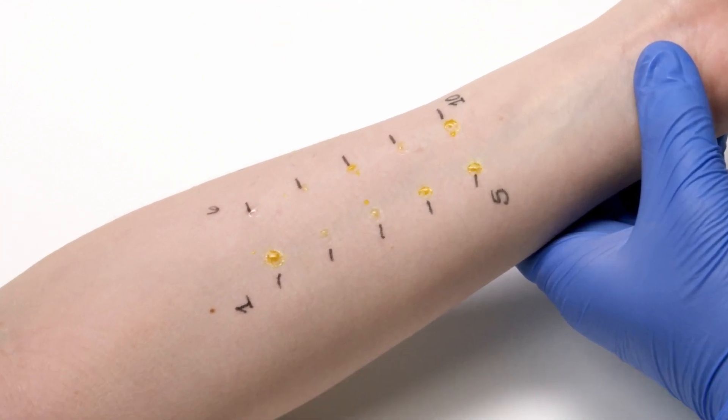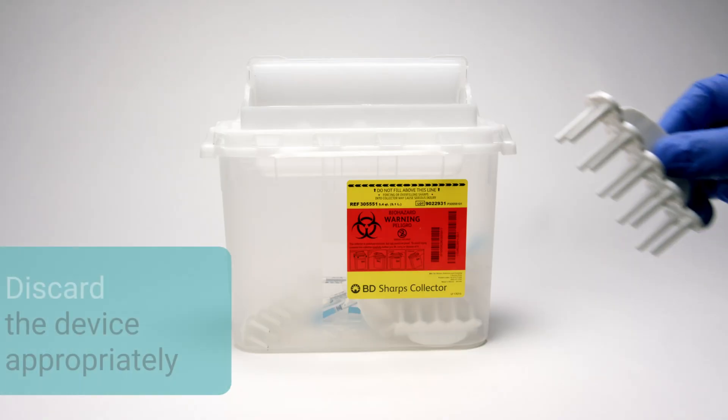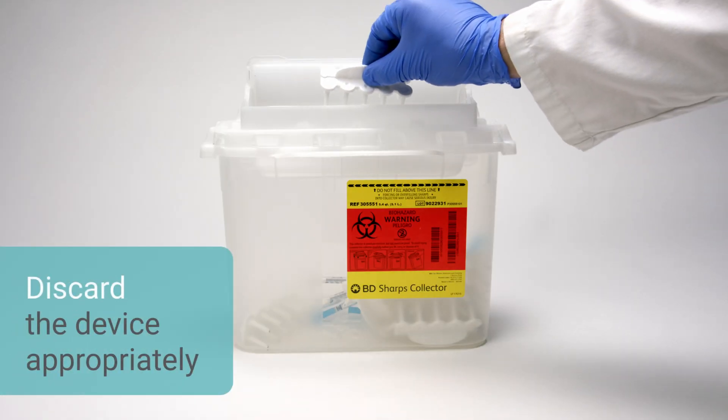Circles created by the depth control guards, about 4 mm in diameter, will be seen at the test site, indicating the correct amount of pressure was applied. Discard the Comforten testing device appropriately.